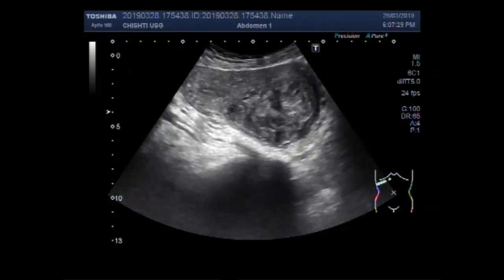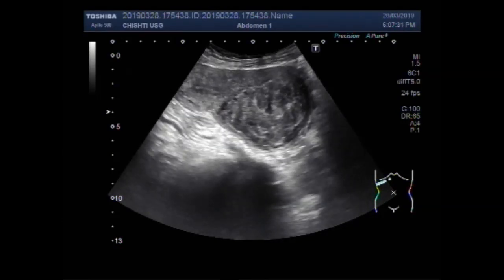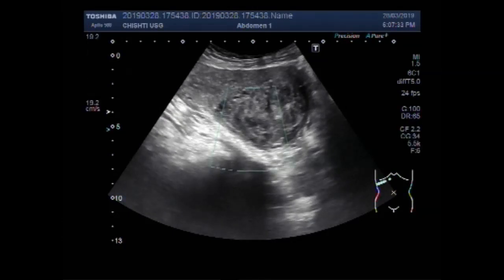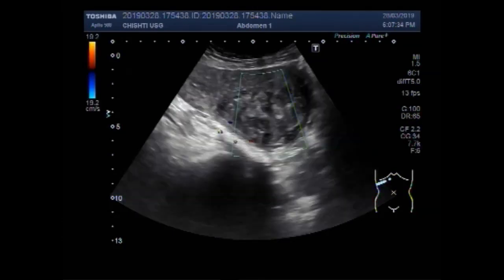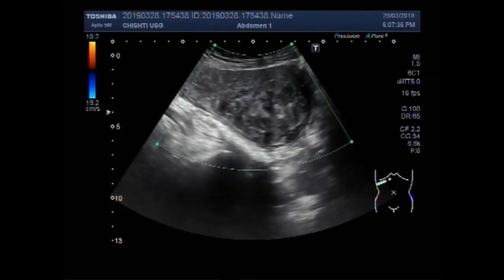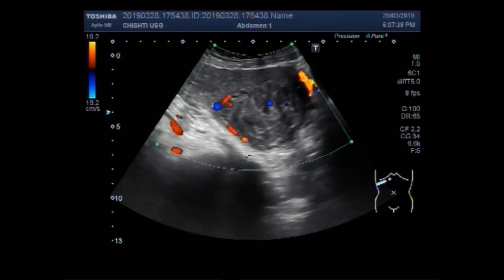Dear viewers, I hope you are all fine. This ultrasound video shows a large uterine mass fibroid with a large ovarian cyst.